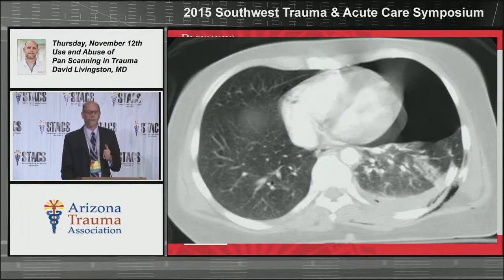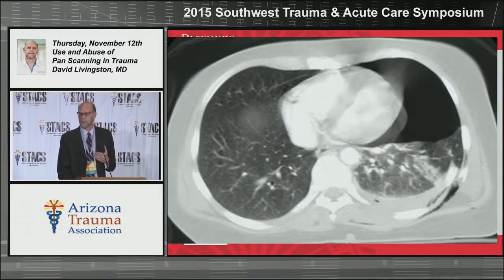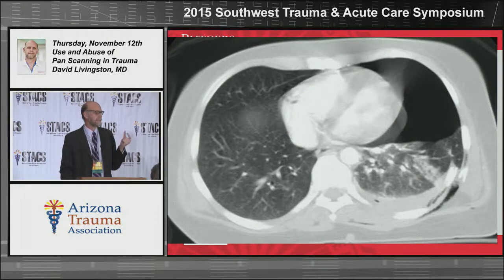Darn. I went back and looked at it thinking I had just missed it, or I was late, or whatever. But the lung is out to the right, and it really does. There's no stripe along the lateral border of the chest wall. And remember what the chest x-ray does, right? It takes additive densities.